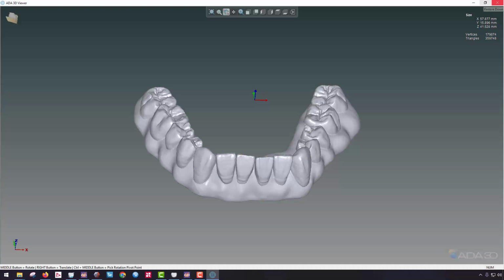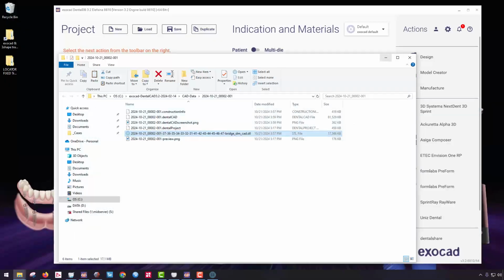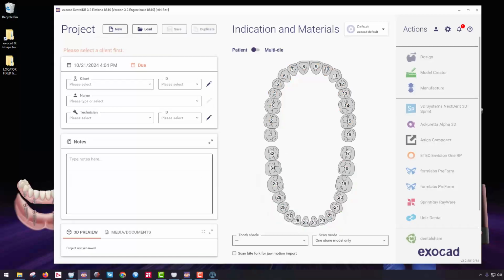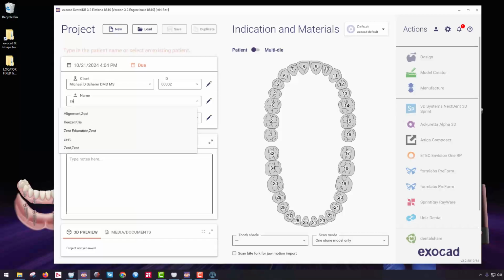Well, historically, it's been a little bit more challenging than it is now, and that's a good thing because now it's super straightforward. I open up exocad, click the New button, and define a client. My name, technician me, and Zest Education. This will be copy denture two-piece from anatomic Pontics demo. That's just my note to myself.